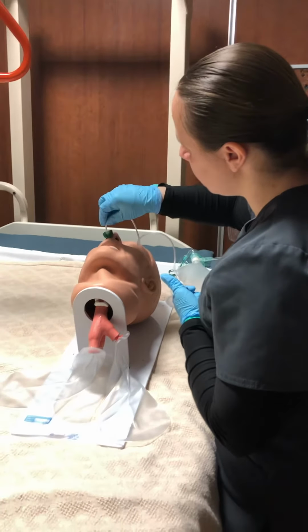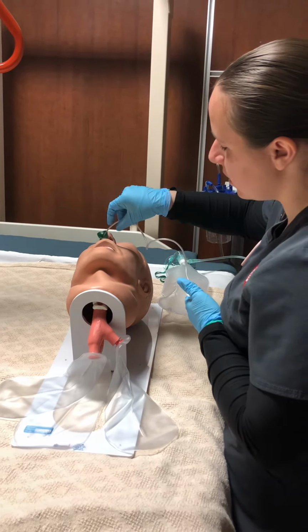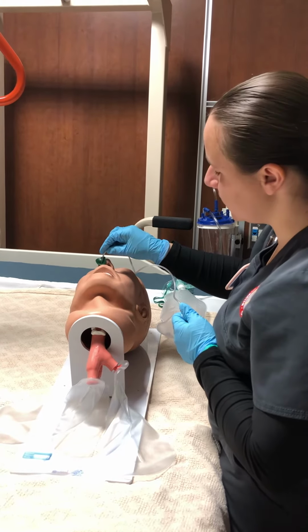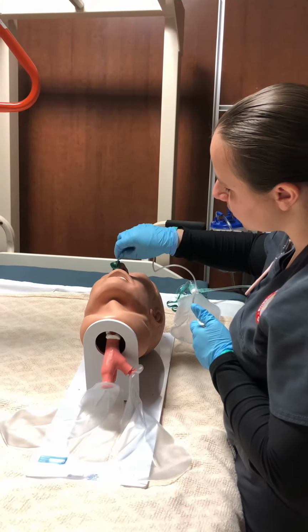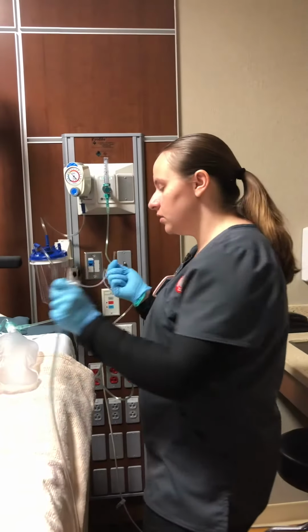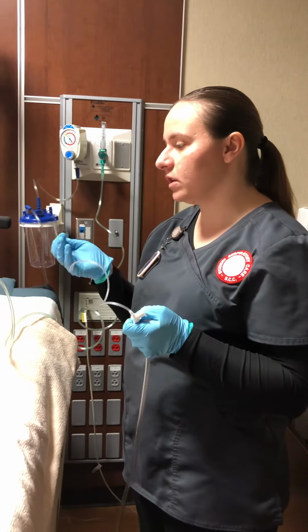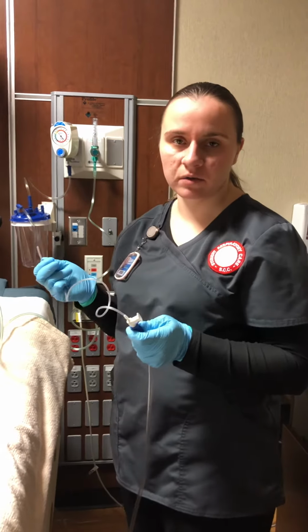And if you feel an obstruction right away, then you can have the patient cough. And then slowly go down in there until you're at the appropriate area. And then you'll begin to suction. You don't want to suction more than 15 seconds. And when you're done, you will slowly move your hand up to the end of the catheter, that way you don't splash anything out when you suction. And when you're done, you always want to place the oxygen back onto the patient, especially after you suction. You want to reinflate their lungs. If we want to do it again, we should only do it at the most 3 times. You don't want to do it more than that because it can cause complications for the patient.